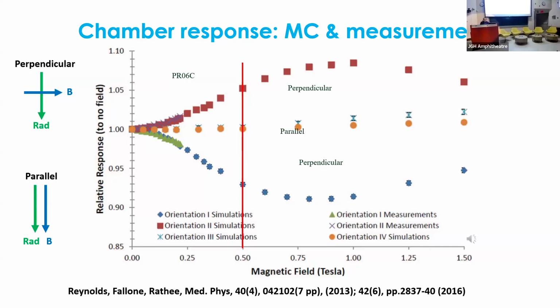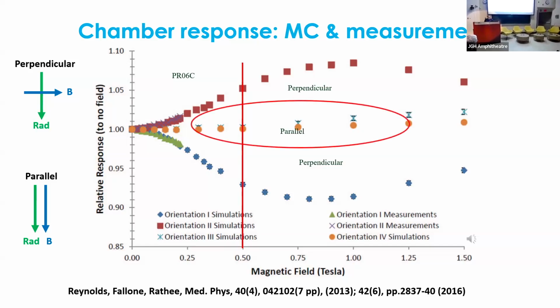So imagine the trouble physicists would have trying to figure this out, with all these ion chambers and the magnetic field there. It takes 3 times more. So if commissioning a linac takes 3 months, with an MR linac it'll take you 3 times that. And look at our case now: it makes no effect.